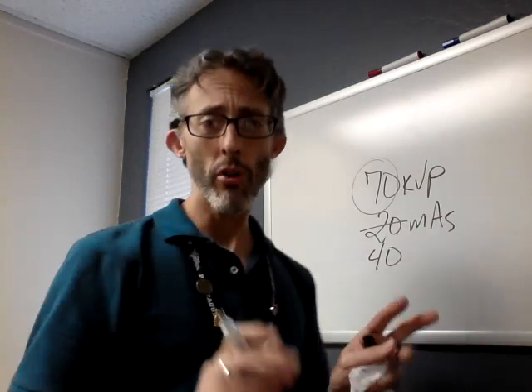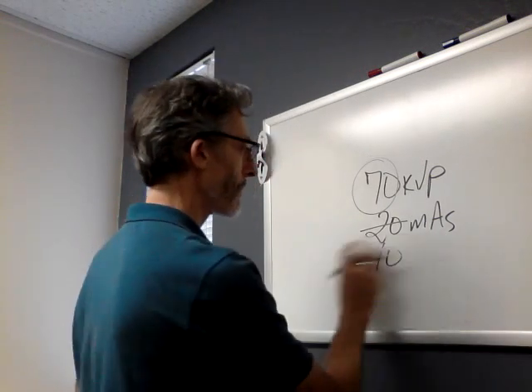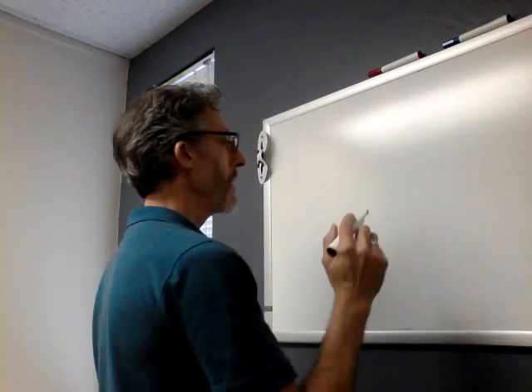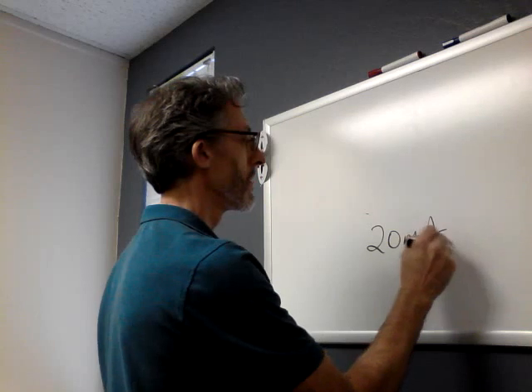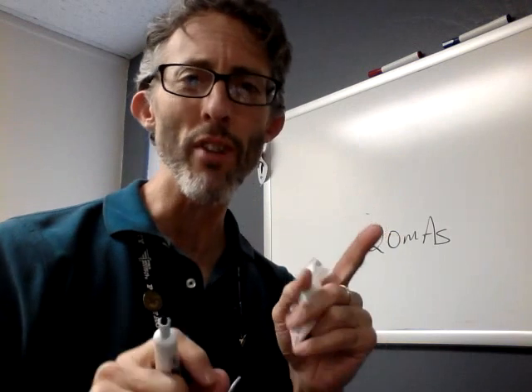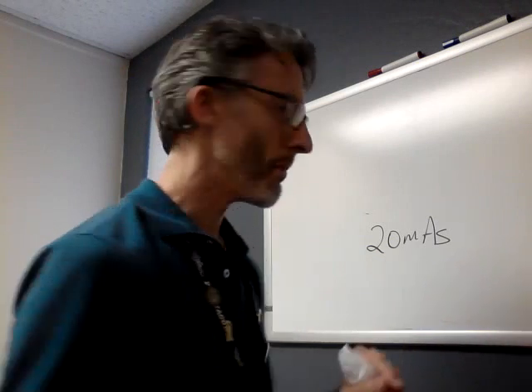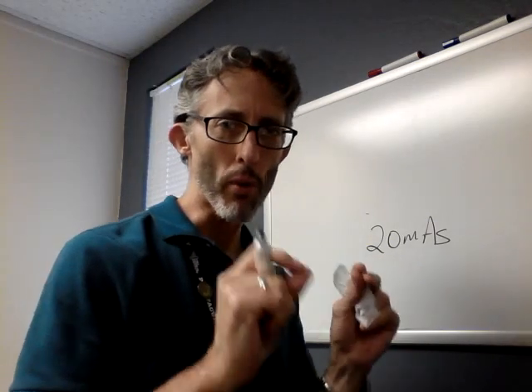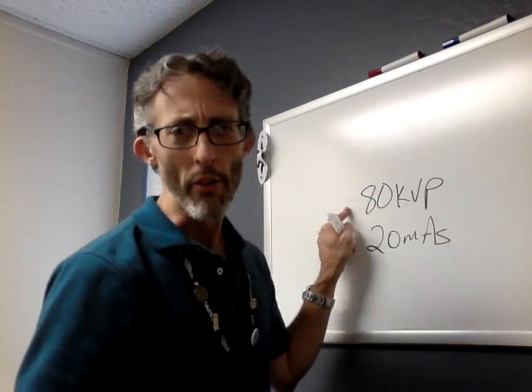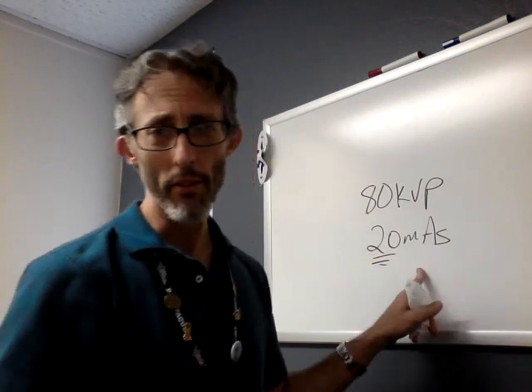So the 15% rule allows us to solve this problem in a different way. How we could do that would be for us to continue to use 20 mAs, but instead of using 70 kVp, we increase the kVp by 15%. That's roughly 10 or 11 kVp, right around there. Let's just say 10 to keep this simple. So instead of using 70 kVp for the repeat, we increase it by 15% to 80 kVp because we know this increase of 15% is the equivalent of doubling the mAs to 40.